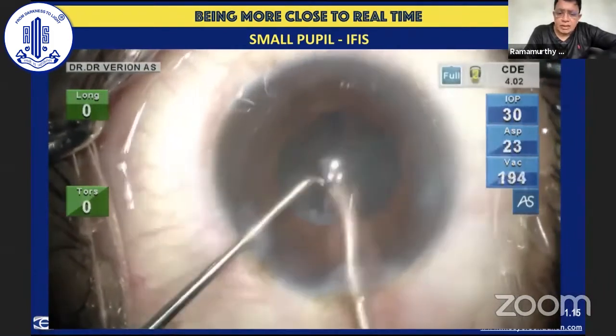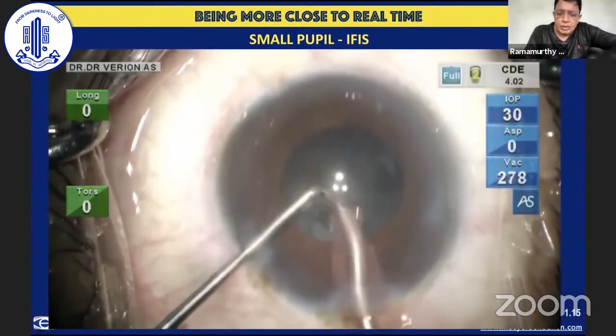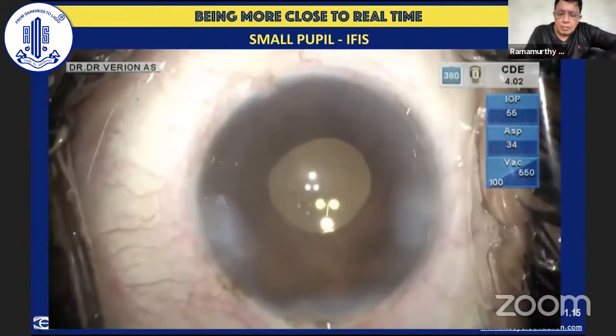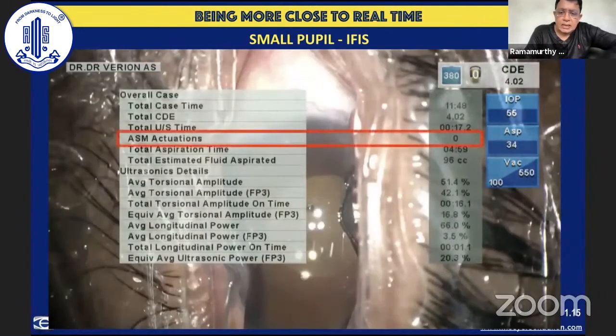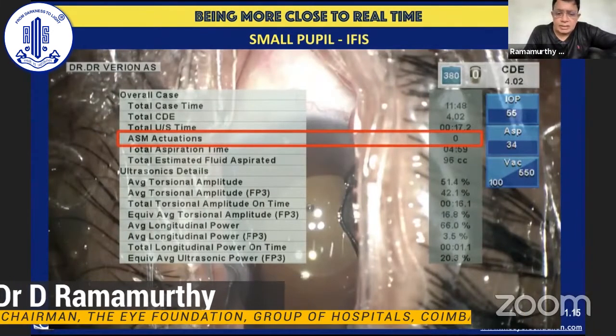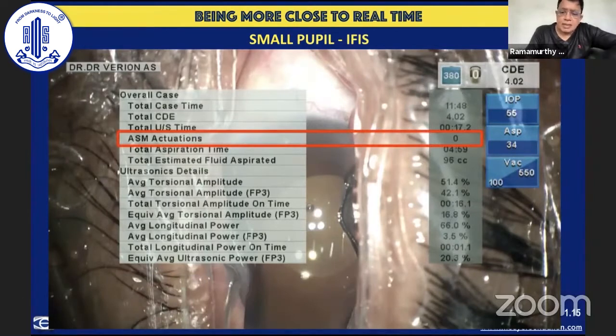There's less tendency for the iris to flow into the phaco tip. And the pupil dilatation that was initially there is maintained almost right through the surgery. I have made it a point, at least in my initial days, to have a look at the number of times the Active Sentry has been actuated.